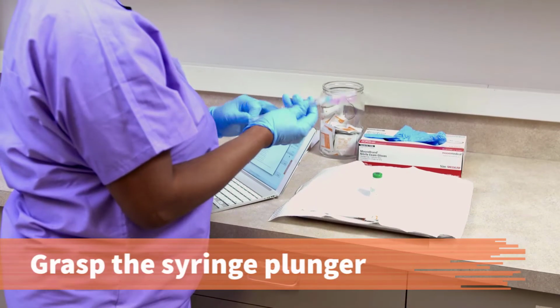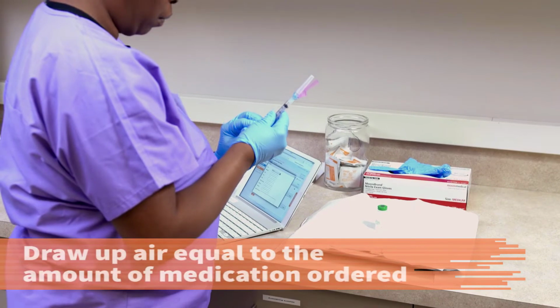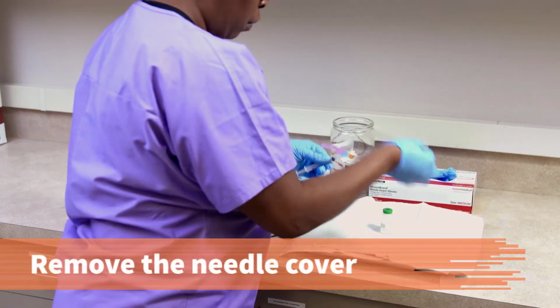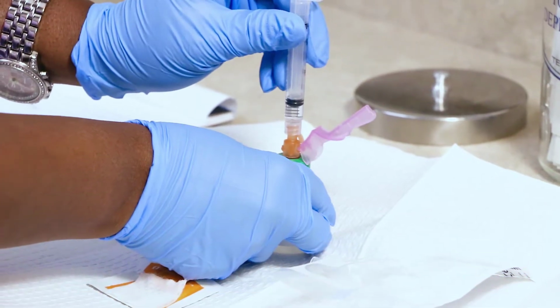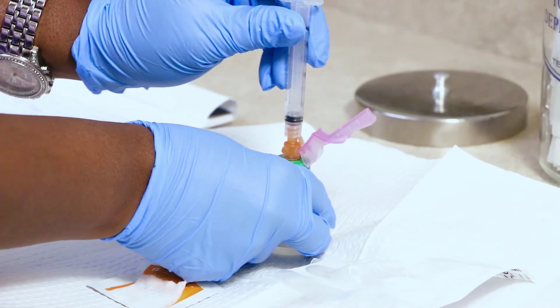With the needle cover in place, grasp the syringe plunger and draw up an amount of air equal to the amount of medication ordered. Remove the needle cover. Hold the vial firmly against a flat surface and insert the needle into the center of the rubber stopper. Careful that the needle touches only the cleaned rubber area. Inject the aspirated air in the syringe into the vial, making sure the needle is not in the liquid.